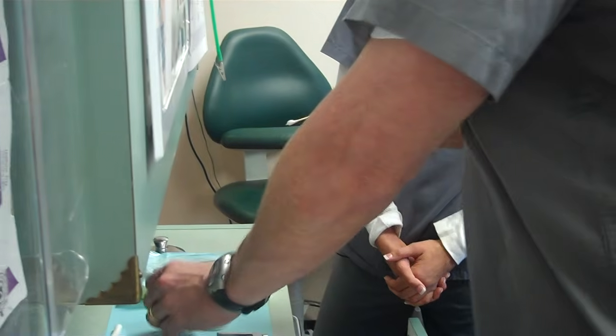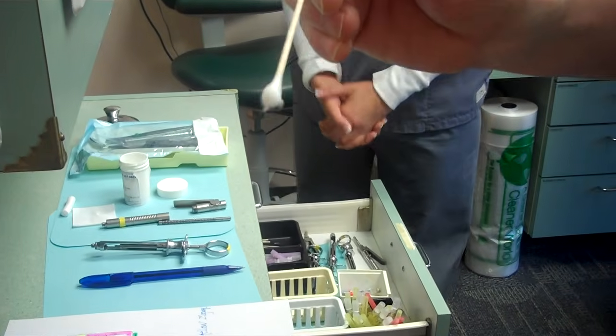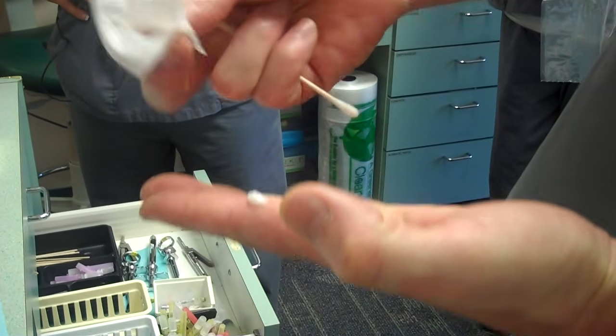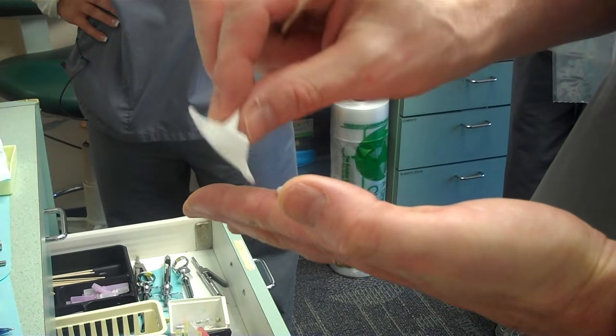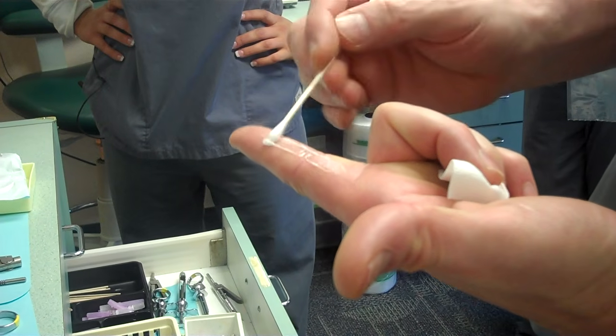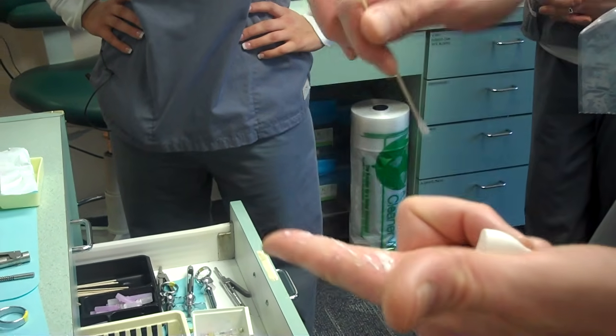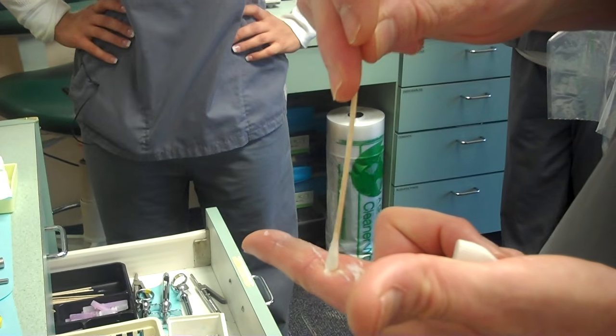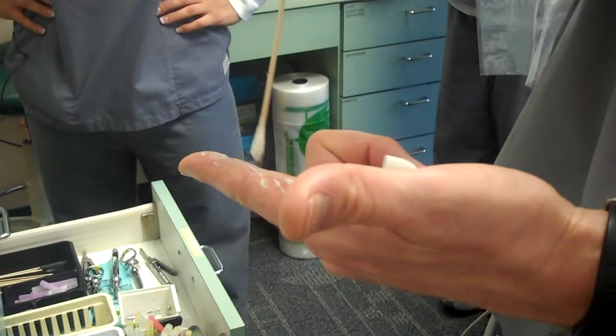I want a little bit, that much, put on the end of a Q-tip. I want it placed on the gum tissue in one spot, like that. And I want it covered with either a 2x2 or a cotton roll. I do not want it slathered all over the place because I'm not giving a shot all over the place. I'm going to give an injection usually in about one spot, and that's the only spot it needs to be.